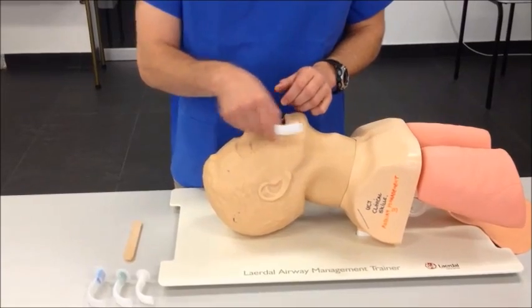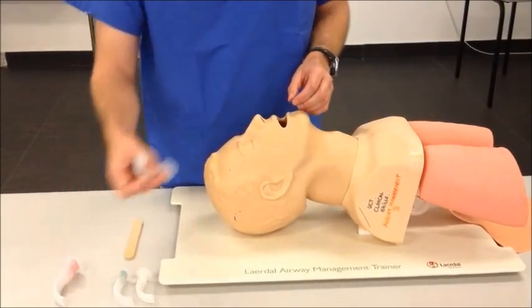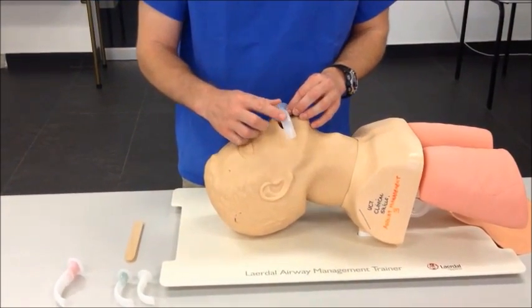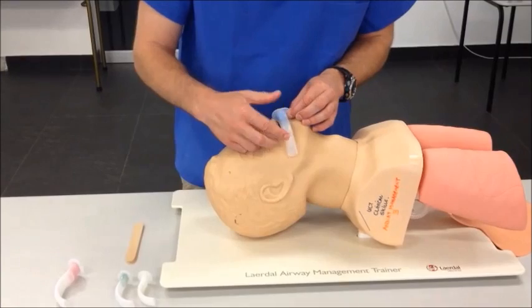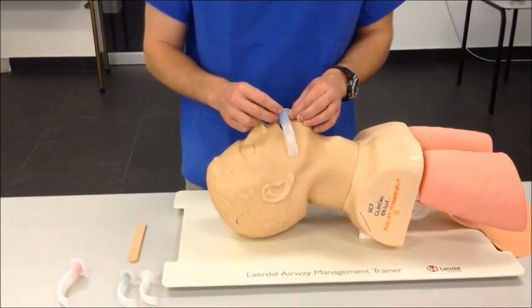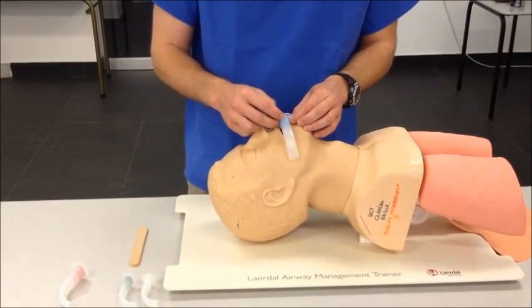If we take a smaller device, you can clearly see that when laid by the middle of the mouth, the device ends in the middle of the cheek and is inappropriately sized.